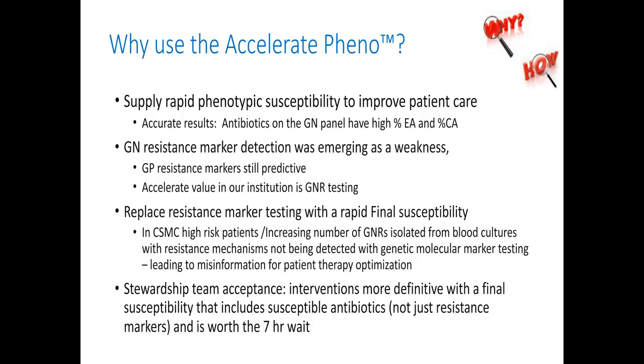Let's get started. Our first question is, what advice do you have for a lab director to gain alignment from her or his organizational leadership to move forward with implementation of new diagnostic equipment? Well, that's a very interesting question. I guess the first thing I would say is that you need to do your homework. Is the diagnostic equipment really going to offer something of value to your hospital, to your stewardship group, to your group of physicians and patients that will be using the information?